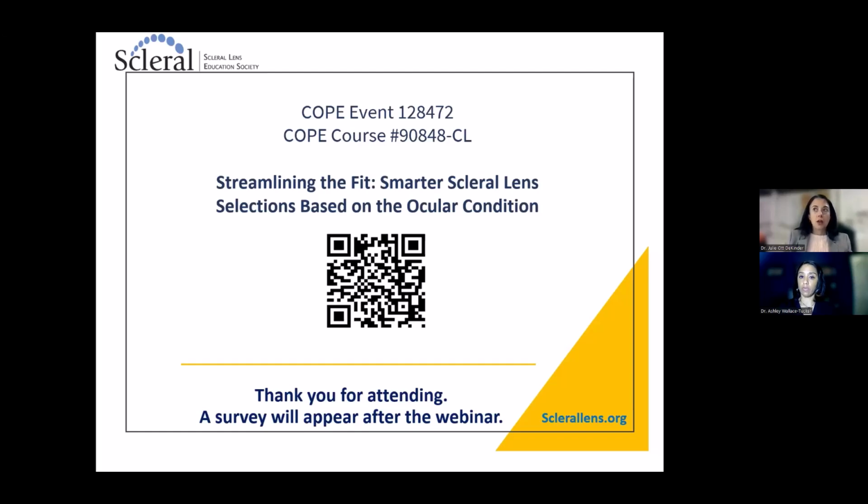I will say that early on, I almost exclusively used an oblate design because I really liked that lens. And now the lenses that I use tend to be ones where you have to incorporate it in yourself. So that is why I would say, sure, there's nothing wrong with using an oblate design at all. You can always manipulate it by changing the base curves to get what you want.